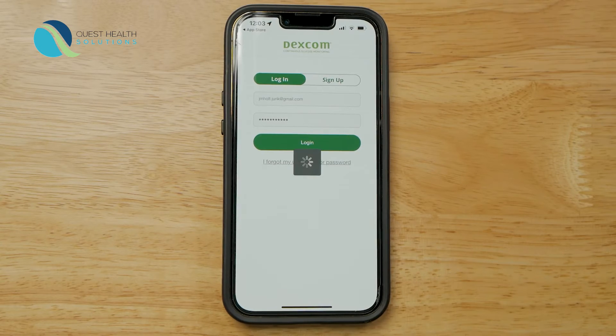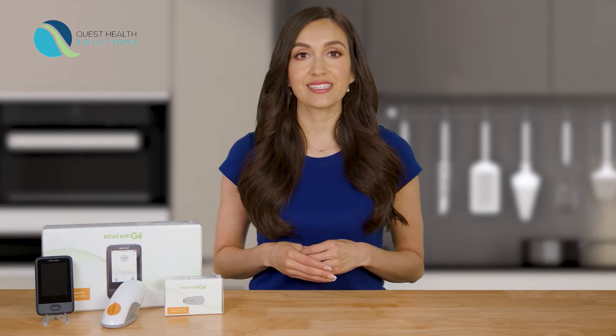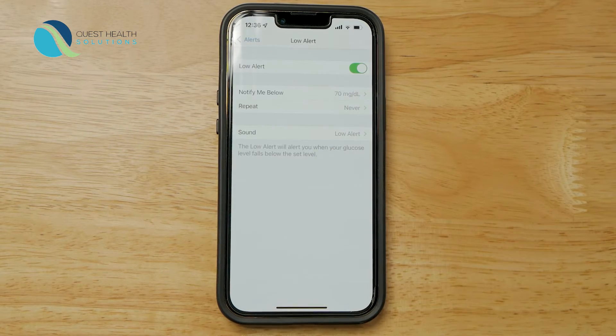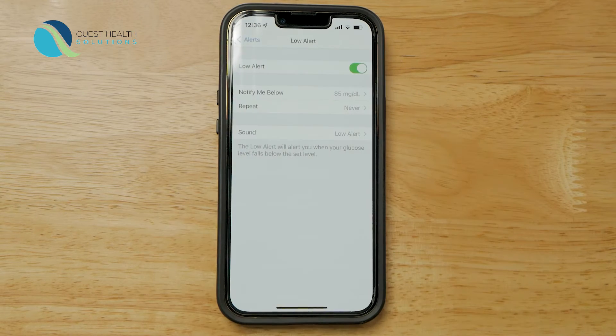Let's get started. The first few screens provide information and videos. Watch these videos and read the information screens. You will come to a screen where you'll need to set your low alert. It's a good idea to set your low alert to a number that gives you time to react before your glucose gets too low. Once you set your low alert, tap save.